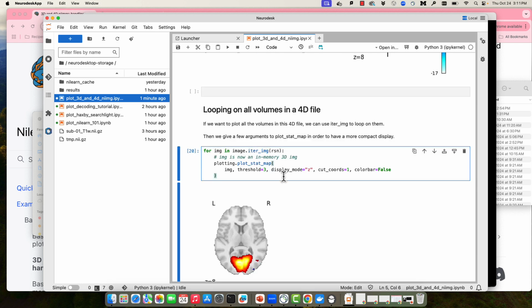I'm not that familiar with Nilearn so far. I've just started using it recently, but it appears as though when you try to display all of the 4-dimensional images for like a functional data set, for example, it doesn't do particularly well. It wants to display one image at a time. That said, there are more interactive plotting mechanisms that are a little bit more advanced. I'm not sure if they're within Nilearn specifically. I do know that NL Tools has some, but it appears to not be working that well right now, or I'm not able to get it to work that well, but just be aware for right now. It looks a little strange, but here's what we're working with here.